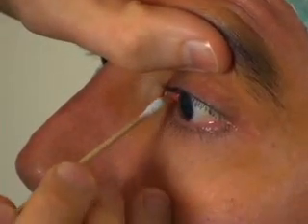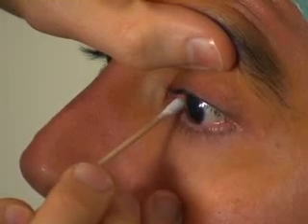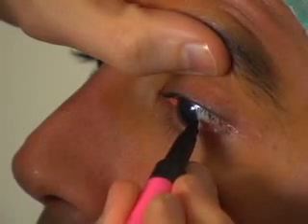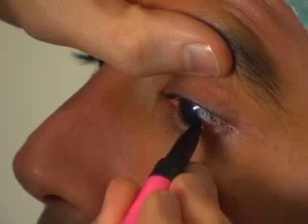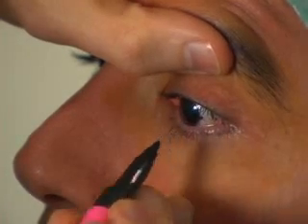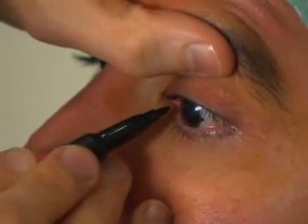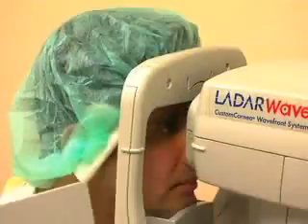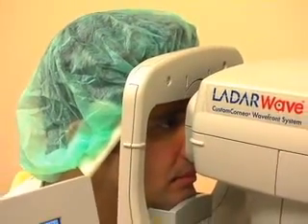We first need to make registration marks on the eye, which account for cyclo-rotation. After applying a numbing drop, we pre-dry the limbal area with a Q-tip, which helps the ink marks become very adherent. Afterwards, we use a special pen that makes tiny little dots right in the limbal area of the conjunctiva, and these are the registration marks.